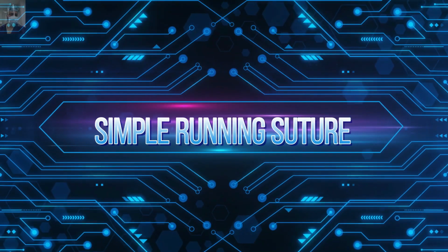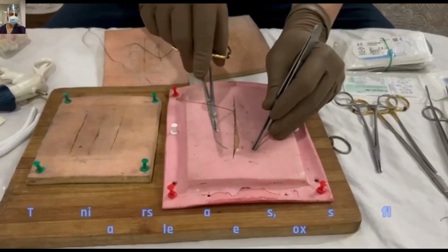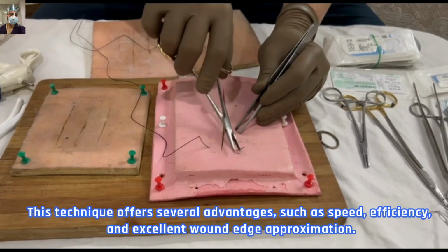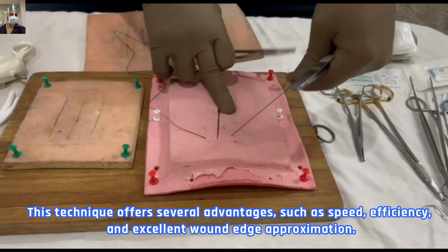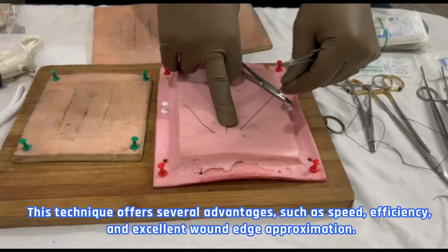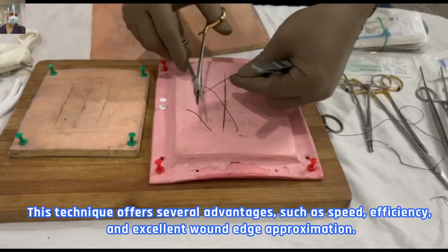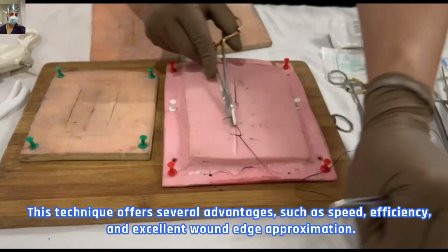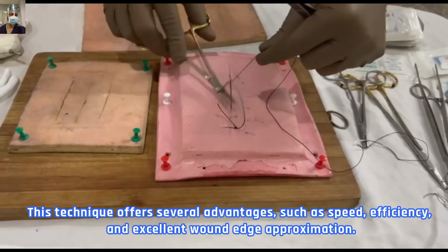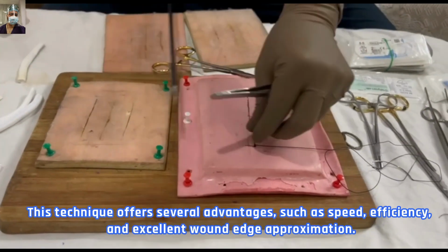So, like if you are suturing a long wound where you want to save time, then this is a very good suture. There are fewer indications, but the results are equally good as compared with the interrupted suturing technique. So the first suture is a simple interrupted suture, and we don't cut the long end. And now we progress along the wound length.